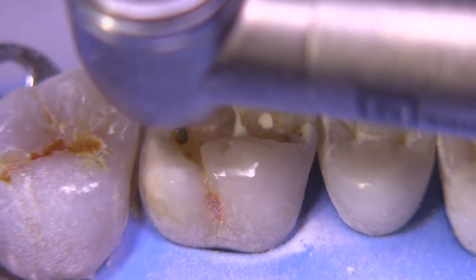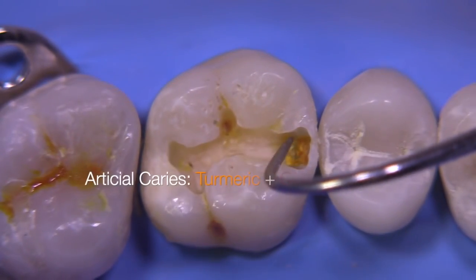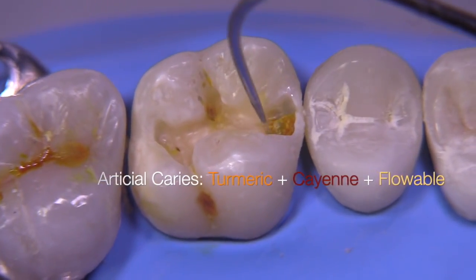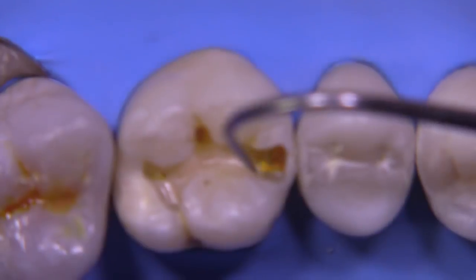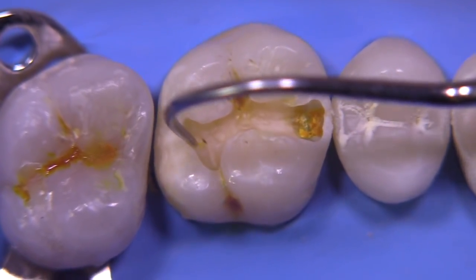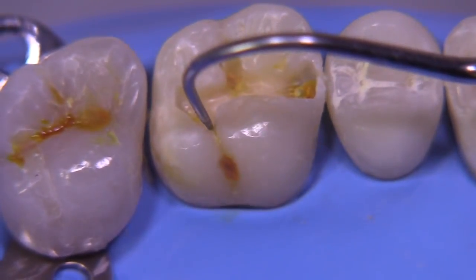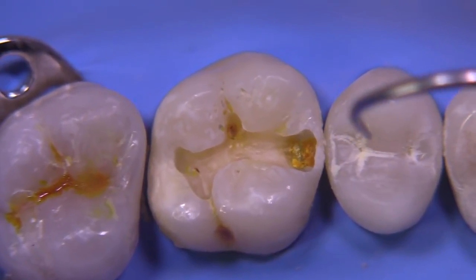I made this artificial caries with a combination of turmeric, cayenne pepper, and flowable composite, and it looks really real — it's kind of cool. You can see here that there's caries on the mesial, we have no caries on the distal, we have a caries lesion on the lingual and the lingual fissure area there, and we're obviously going to need to drop a mesial box.